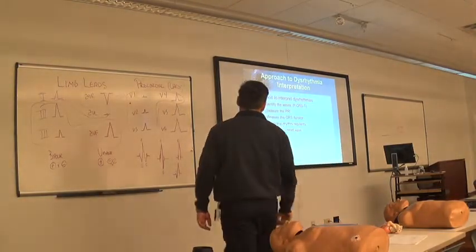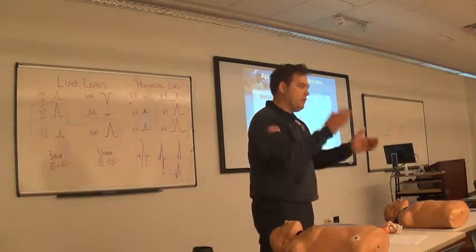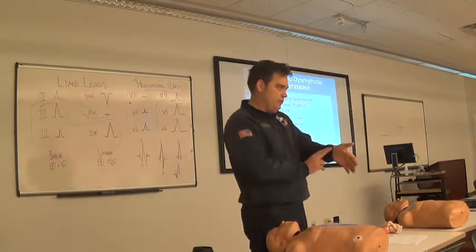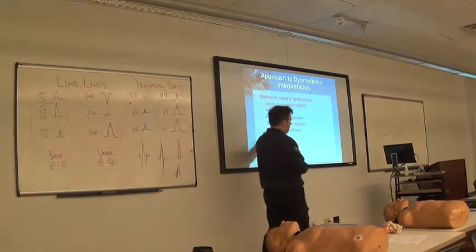Then I want to determine the rhythm regularity. How regular is this thing? Is it regular, going boom, boom, boom? Feeling the pulse, looking at the R waves, nice and regular. I'll show you how we tell that. And then the last thing is, of course, measuring the heart rate.